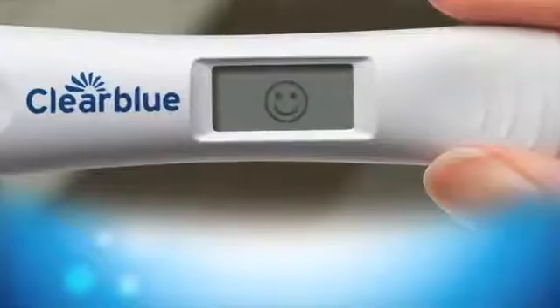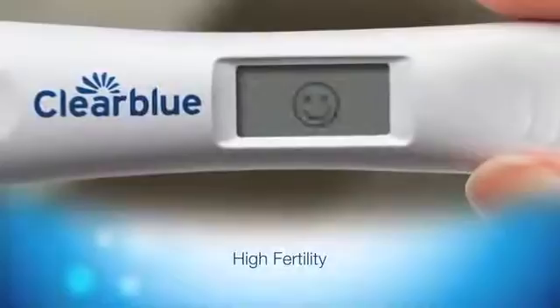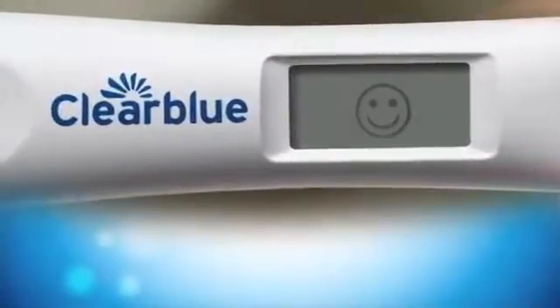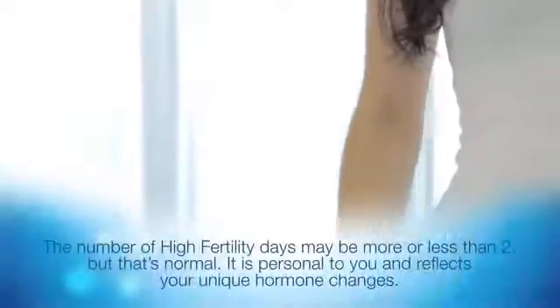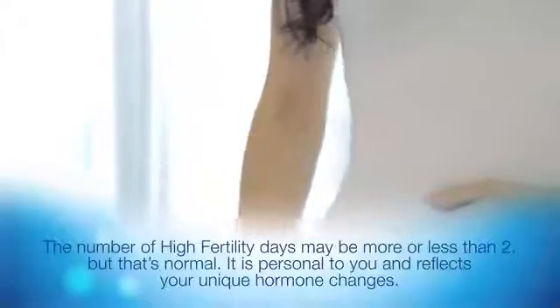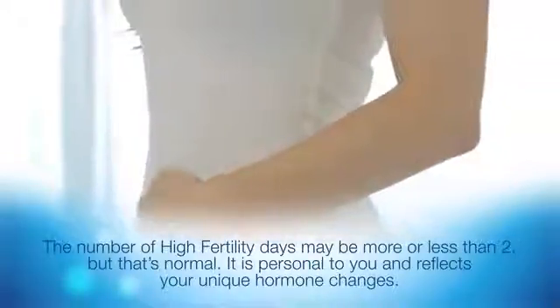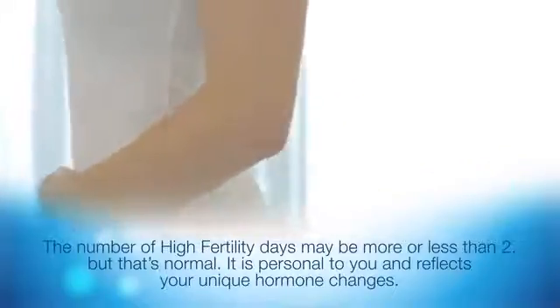Test again tomorrow. If the test shows high fertility, indicated by a flashing smiley face, you can increase your chance of getting pregnant by having sex today, and you should also test again tomorrow. The number of high fertility days varies from woman to woman and cycle to cycle — it may be more or less than two, but that's normal. It's personal to you and reflects your unique hormone changes; it does not mean that your product is faulty.